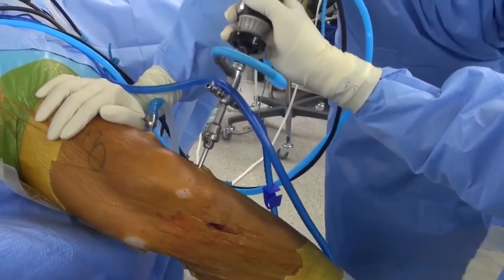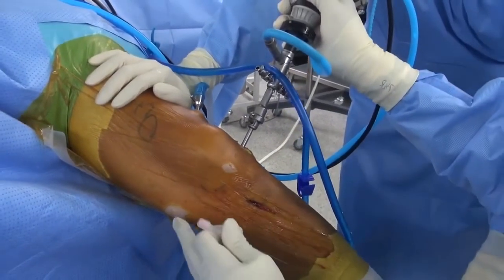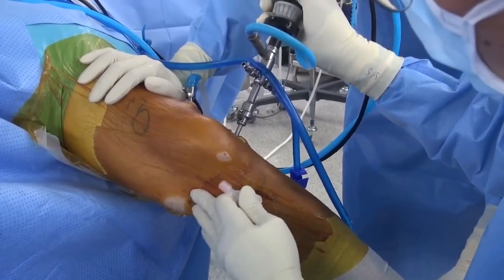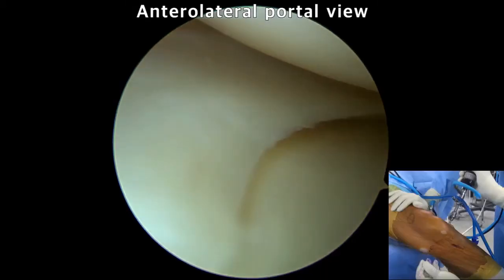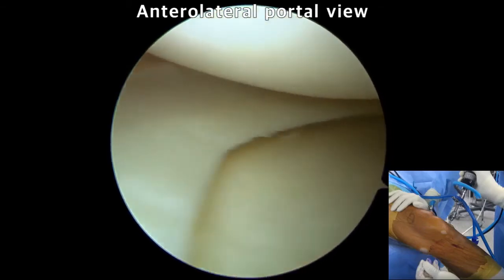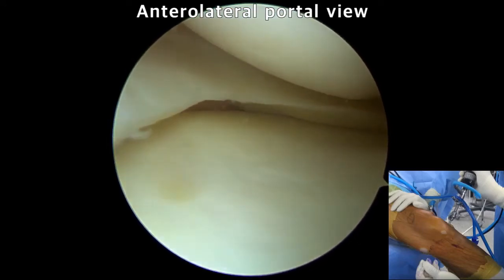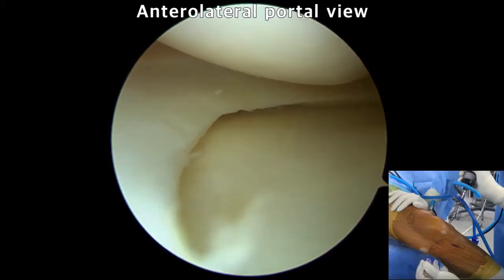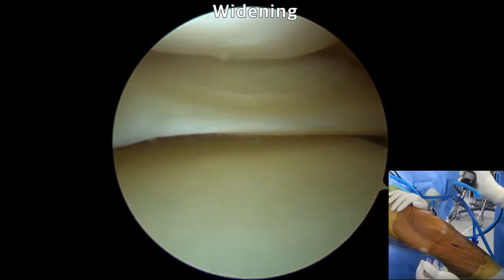Medial compartment release was done with a multiple pie-crusting technique for the MCL on valgus position at 15 degrees flexion with manual assist. After checking surface anatomy, multiple needling on the superficial MCL is done with a spinal needle. In the process of puncturing, we can monitor whether the needle tip penetrates into the capsule. Surgeons should take care not to injure the meniscal capsular junction, the saphenous nerve, and vein. Under the surveillance of the scope, sufficient medial compartment releasing could be confirmed, and at the same time, excessive widening could be avoided.